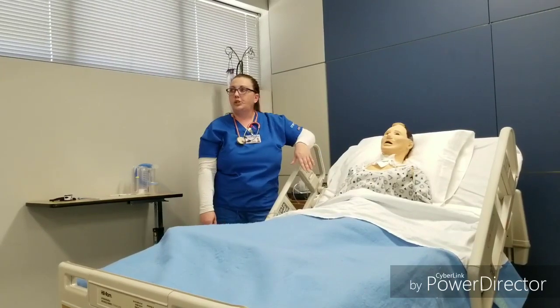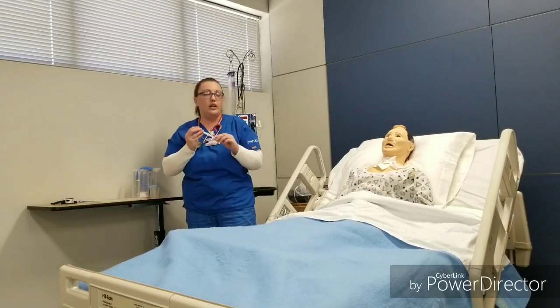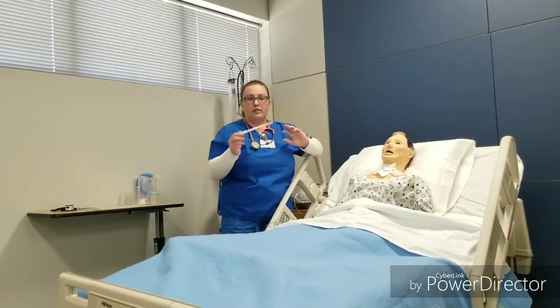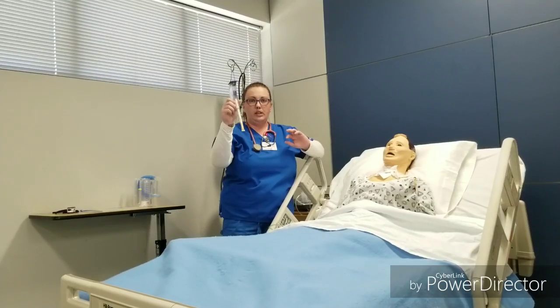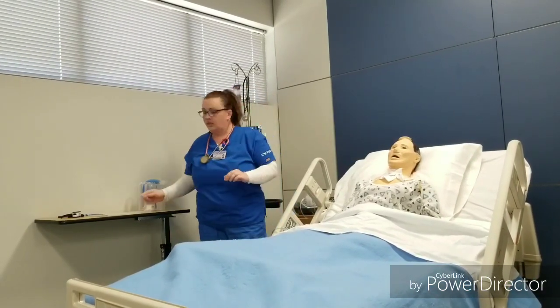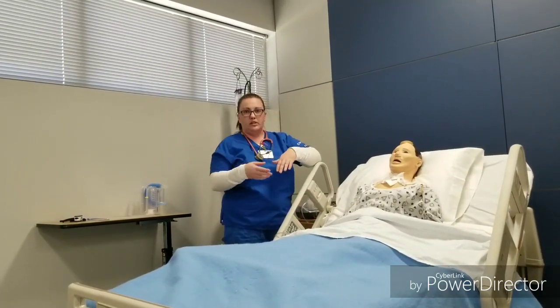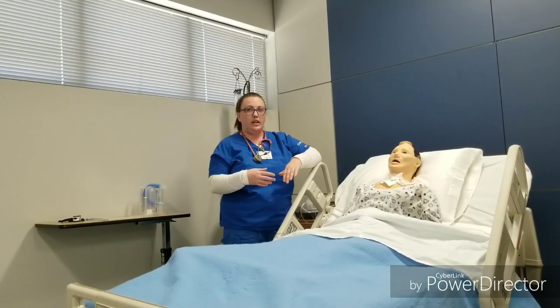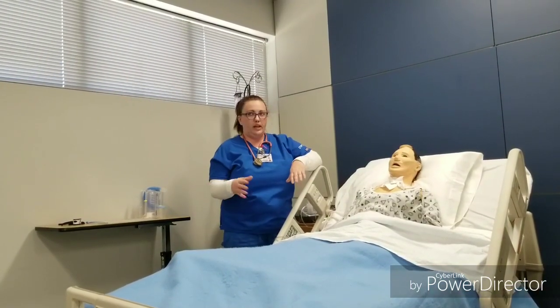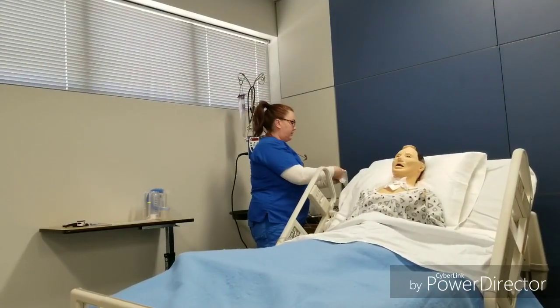And now we're going to perform a throat culture. For this, the supplies you'll need are a pair of gloves and one of these throat culture swabs. And I have checked my orders and identified the patient, introduced myself, hand washing, all that. My gloves.